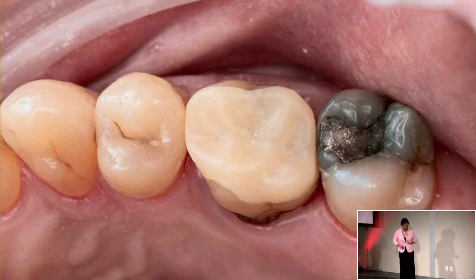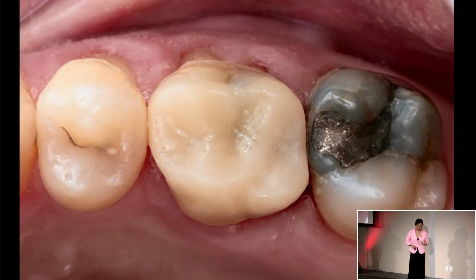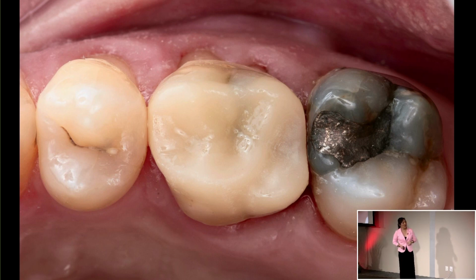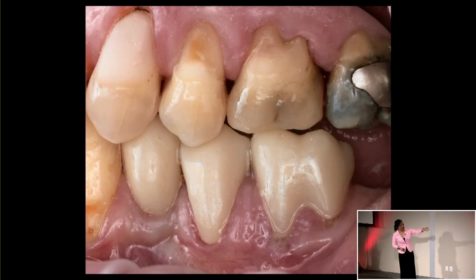And this is how it looks intraorally. And after cementation, this is how it looks after. It's a nice service for the patient. And the reason why I didn't do a full coverage on him is he's actually a full mouth rehab. Eventually, he is going to need a full coverage crown, but this is going to get him by until he's ready. He has quite a bit of buccal recession. He does have on 19 and 20 below, and 21, those are BruxZir crowns now.